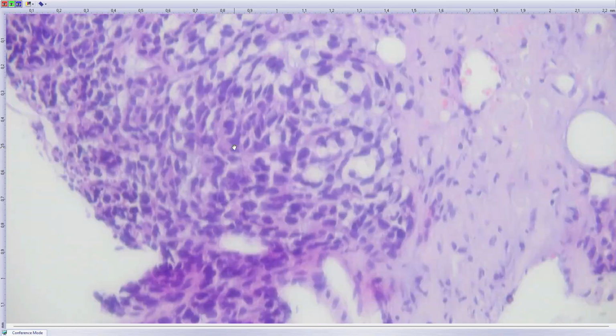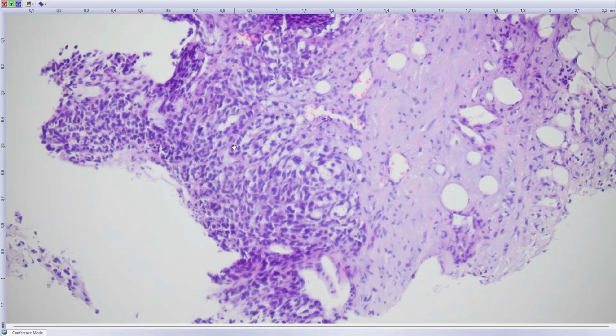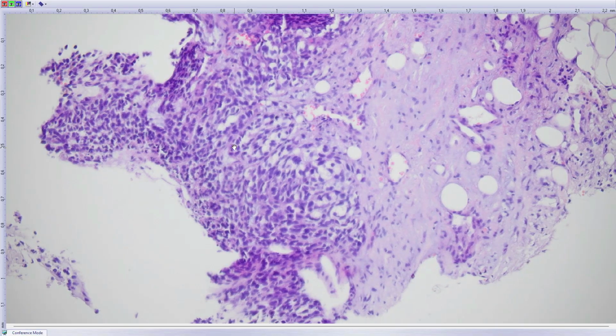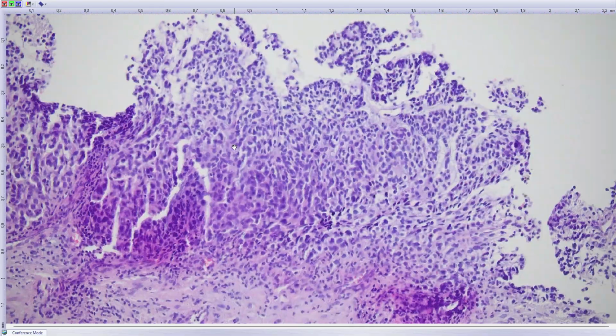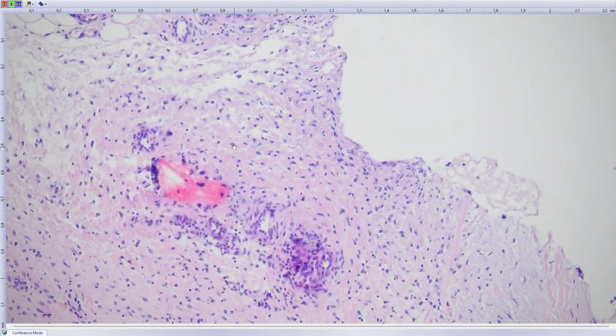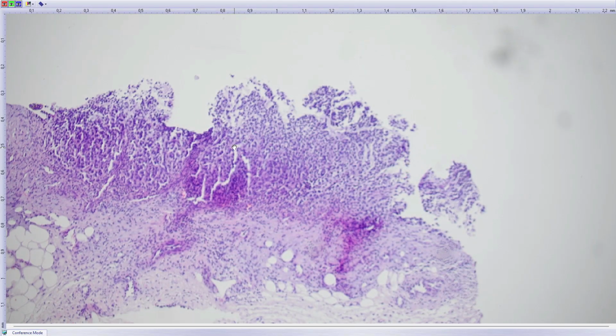This is something I didn't take seriously, because sometimes lipoblast-like cells can be formed by many things, but now I take it seriously. It aligns with the immunohistochemical result, and with the small round morphology of this tumor. The location is perfect, the age group is perfect.